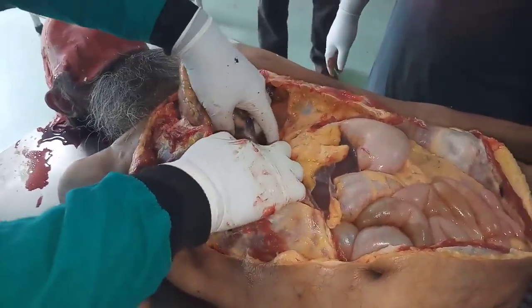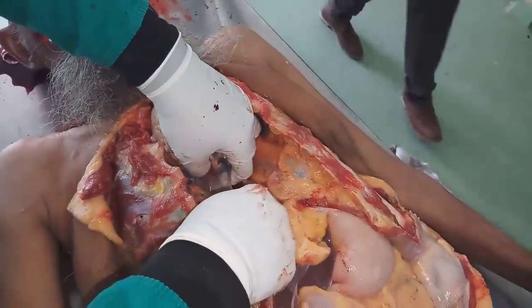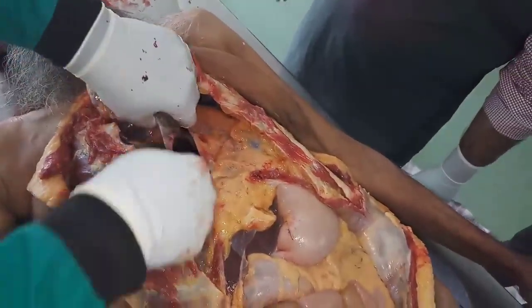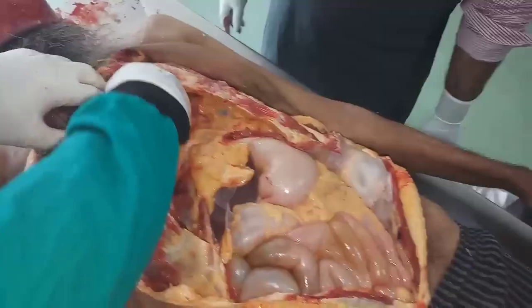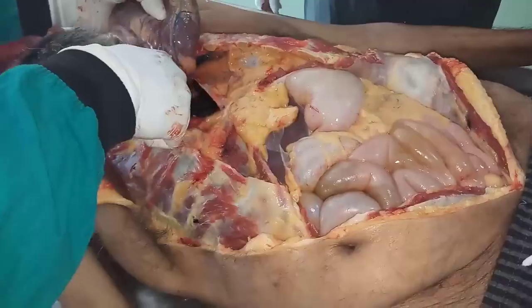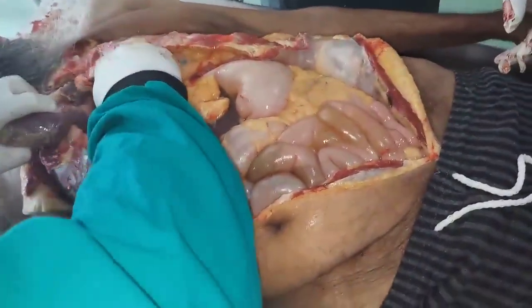So this is the inferior vena cava. I'm going to open the inferior vena cava, cut the inferior vena cava. The blood will come and we'll cut it. This is a clotted blood clot, the postmortem clot. Then above it is the superior vena cava.